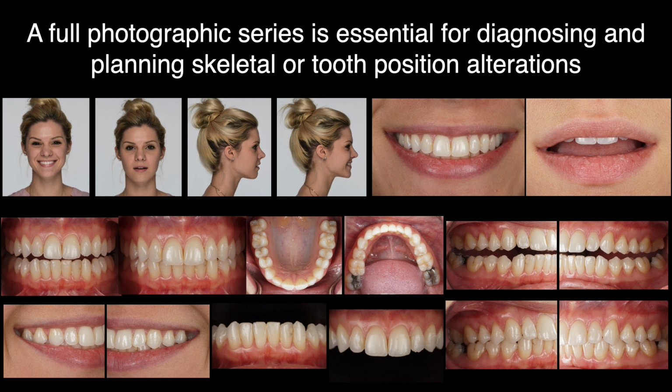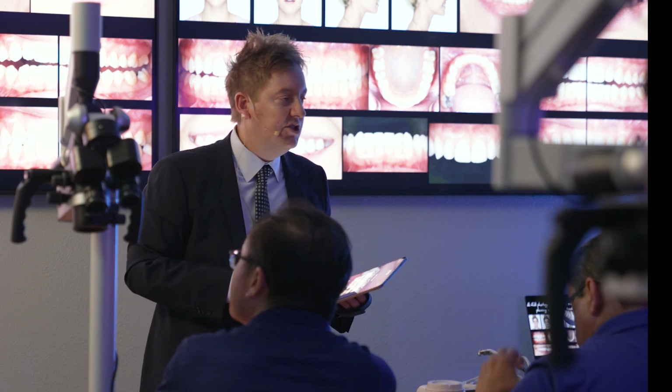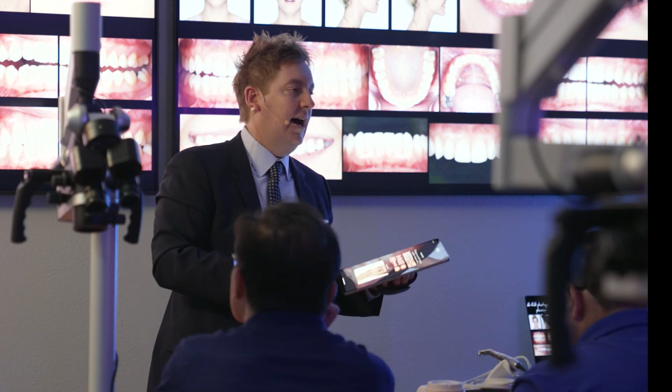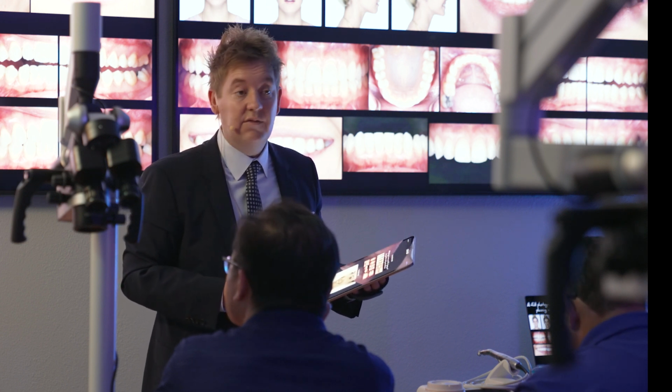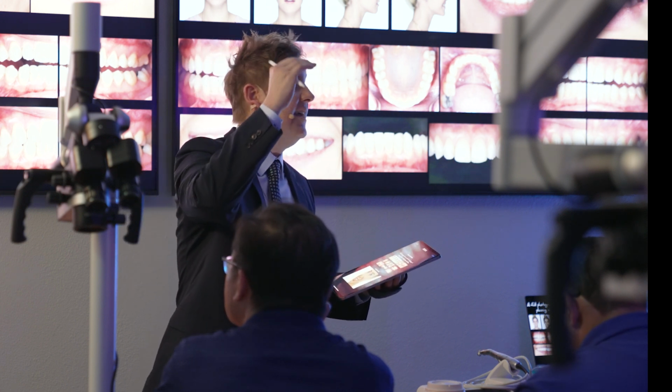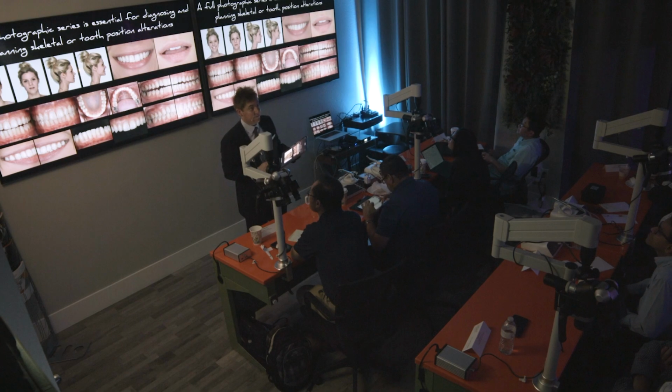And if we're going to be treating from the face, we have to learn how to take the images. We're big on the images here because they help you see what you couldn't see from a clinical standpoint. Just like we have 18 radiographic images in an FMX, we have 18 photos if we want to be able to see anything skeletally that is going on. This is what we consider our full mouth series.